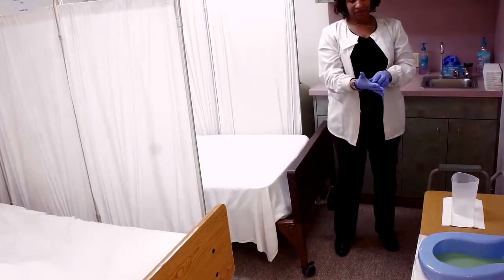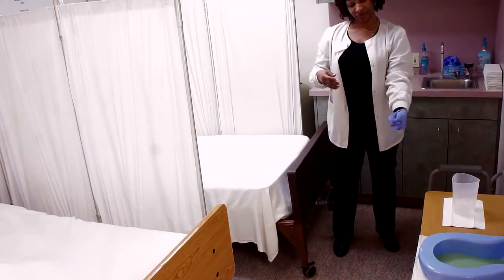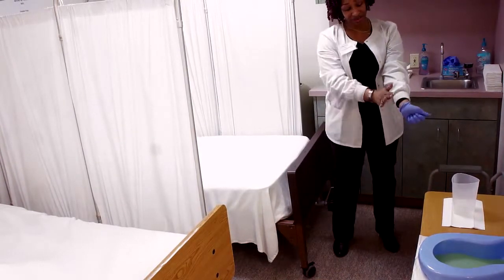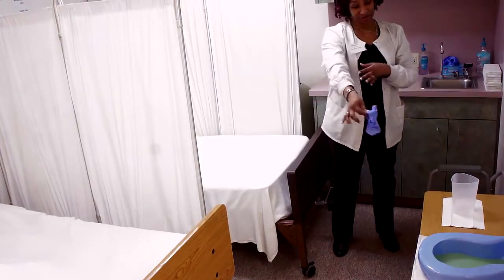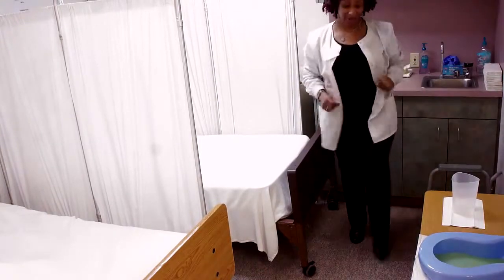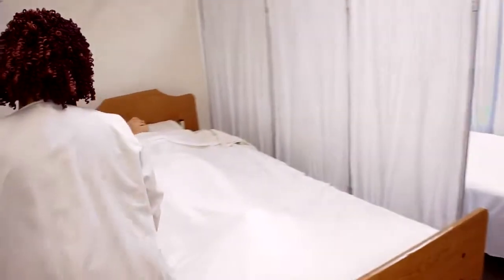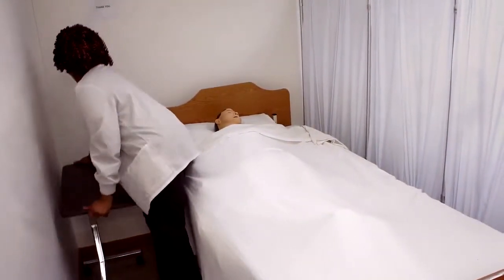Remove the gloves the right way from the palm. Pull it off. Ball it up. Tilt your wrist back and you go under. You don't want to touch the top. Wrist back. Bring it over gently. Bring it off. Then again, we simulate. We wash hands. We go back over. Put the table back. We don't want your patient to fall over the table if they happen to get up.